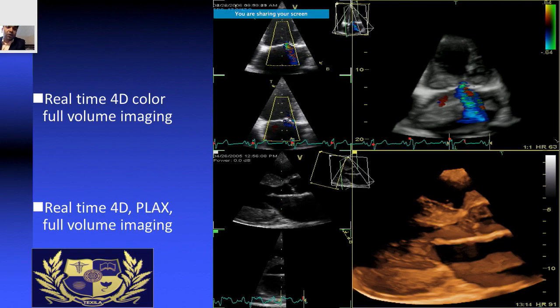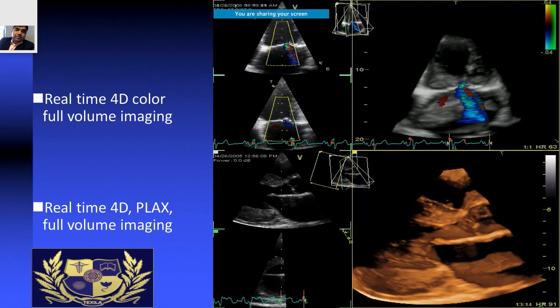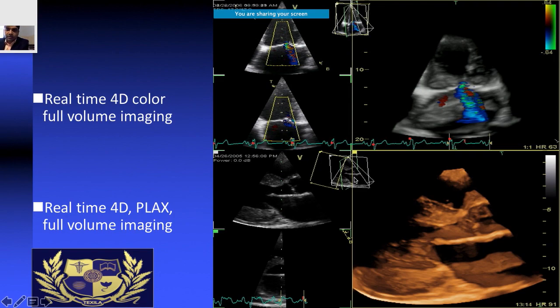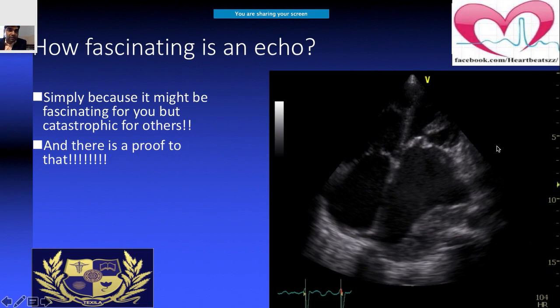This first image is a real-time 4D color echo. The difference between 3D and 4D is the fourth dimension: length, breadth, and height are the three spatial dimensions, and time is the fourth. In 4D imaging, you can observe cardiac motion across time and literally go forward and backward through the cardiac cycle. These echo machines can be costly but are fascinating diagnostic tools.